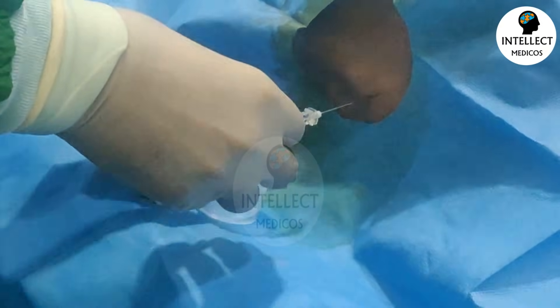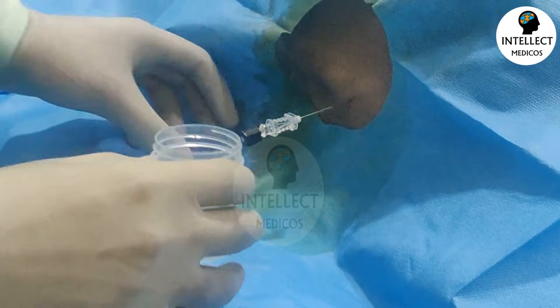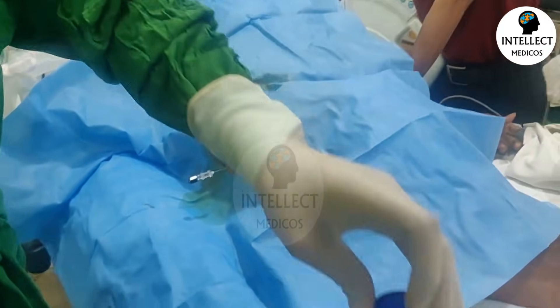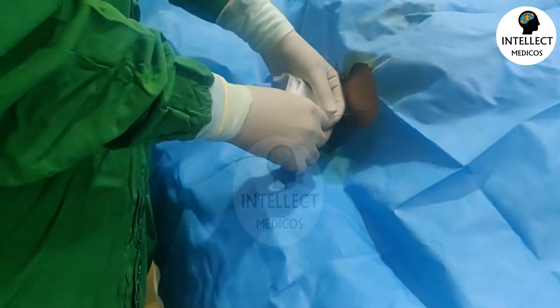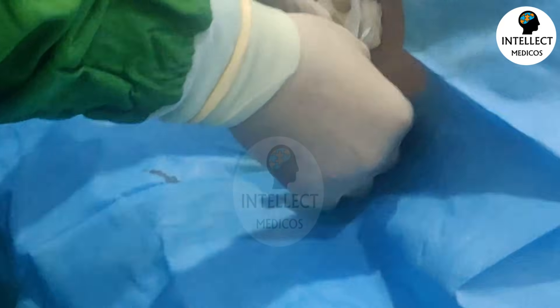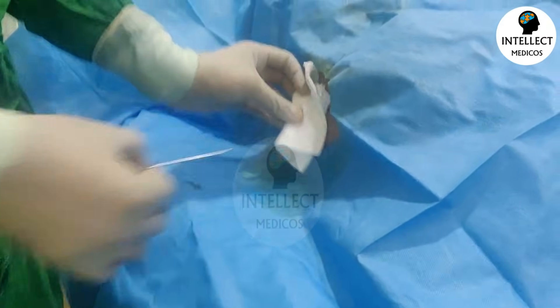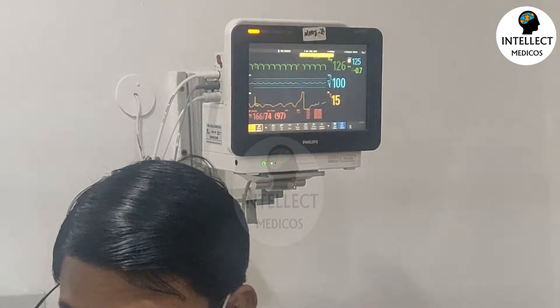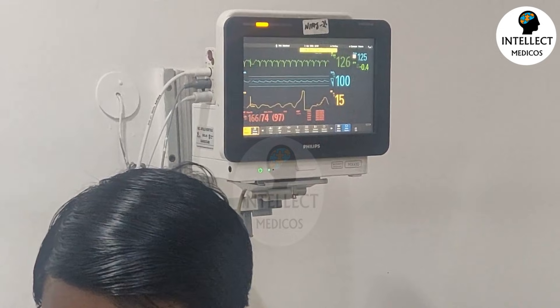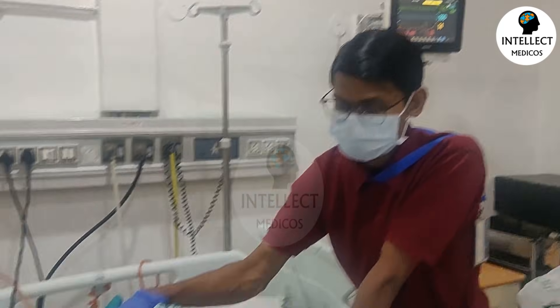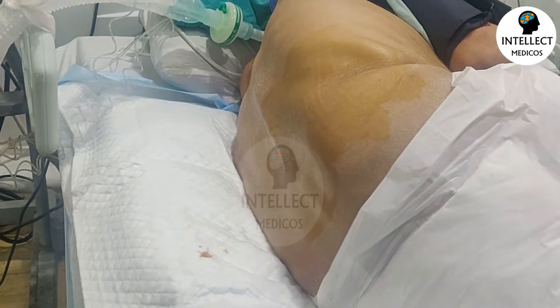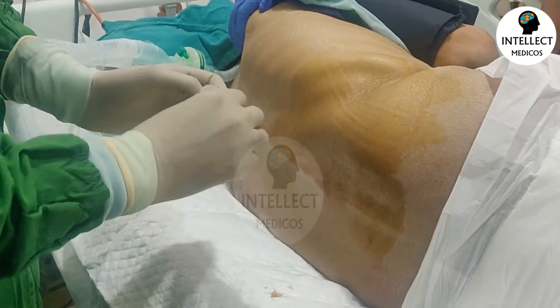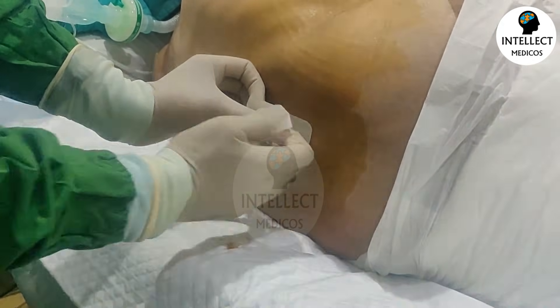Once you have collected an adequate sample, put the stylet back into the needle and close the container in a sterile manner. Then take the needle out as a whole and compress the site for a few seconds. Check the monitor - look at heart rate, breathing, and blood pressure. Clean the site again, put on a dressing, and advise the patient to lie supine for the next few hours.